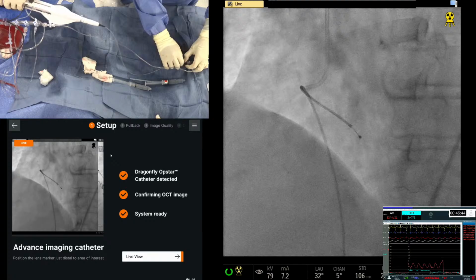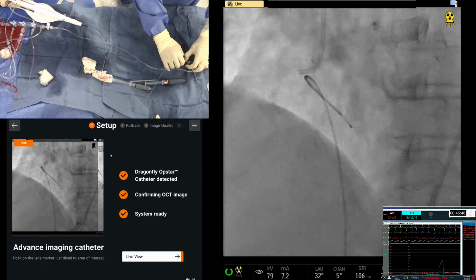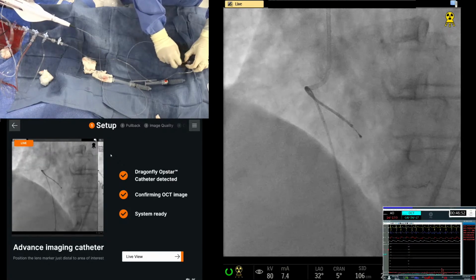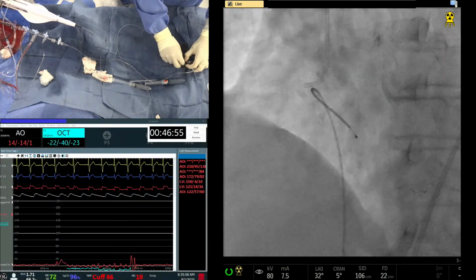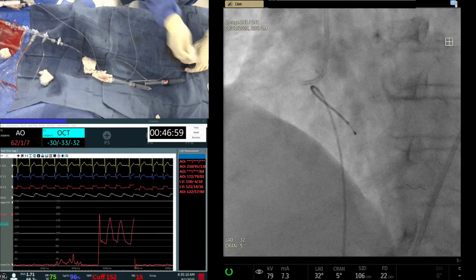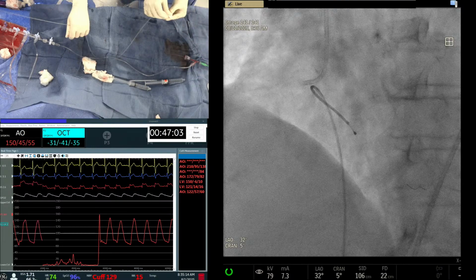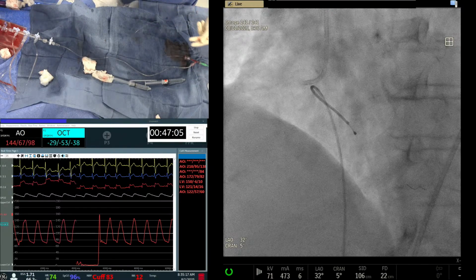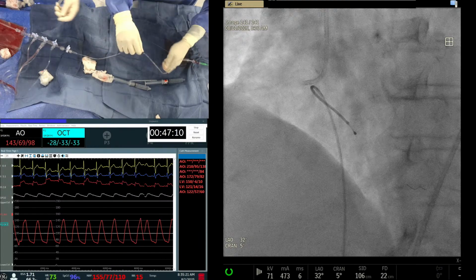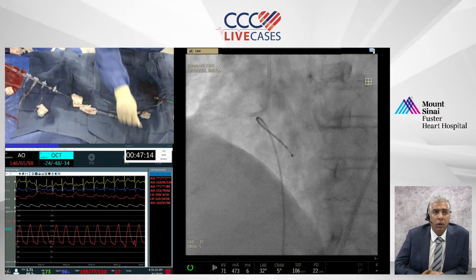Great illustration, Dr. Kinney. Oh, we have it. Okay. We have to get her STs settled before we can do any imaging, okay? Which we knew, when there is a lot of calcific burden, one thing that we do see is slow flow. That's one. And it could also be because we went with a larger burr. Yep. The other component there is just length of lesion, and there were several sequential lesions, so the burden was substantial.